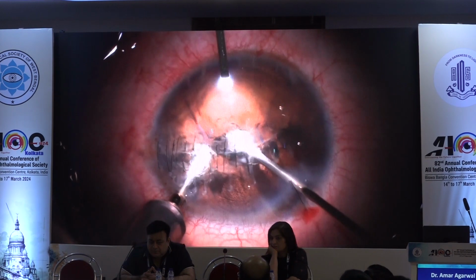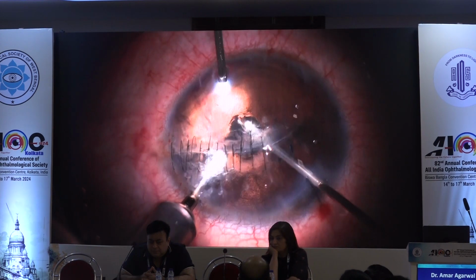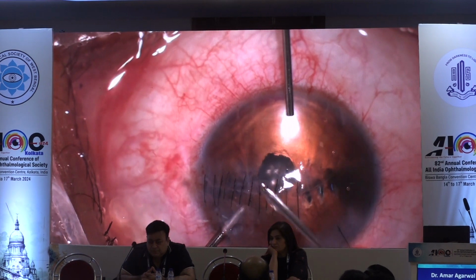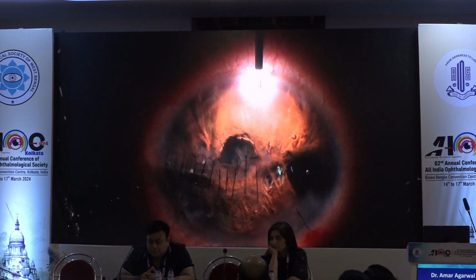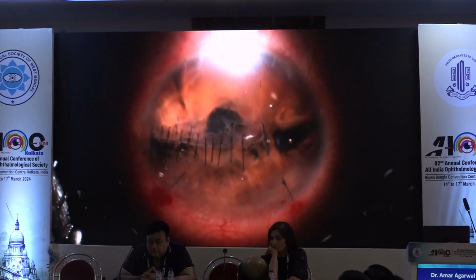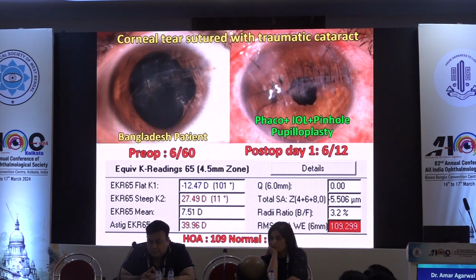But now look, I'm using my endoilluminator, using the vitrectomy probe, I'm just making that slowly and carefully so that my Purkinje image is just missing it. Now, look, this is with the microscope light switched off. Okay, I'm using only an endoilluminator. Now in the night, I didn't sleep. I was just hoping and praying this patient will see the next day. Post-operative day 1, 6/12. Look at that.